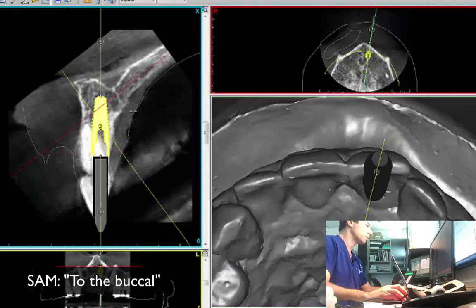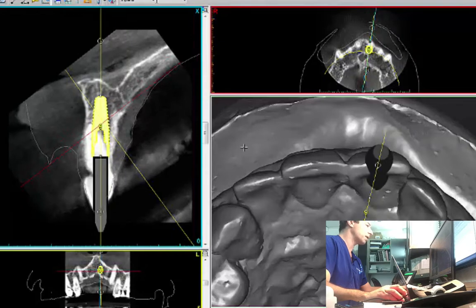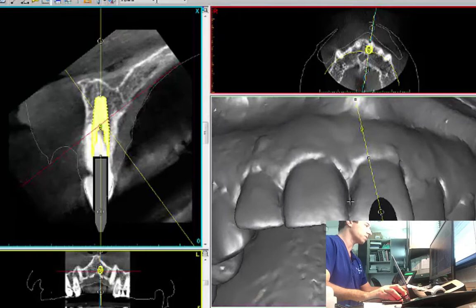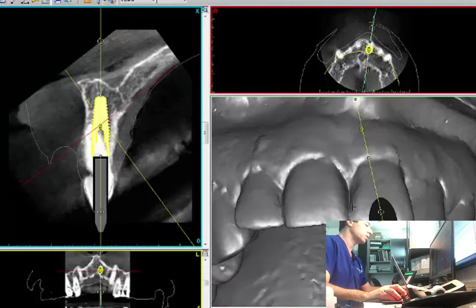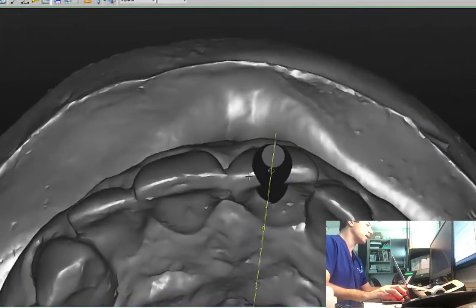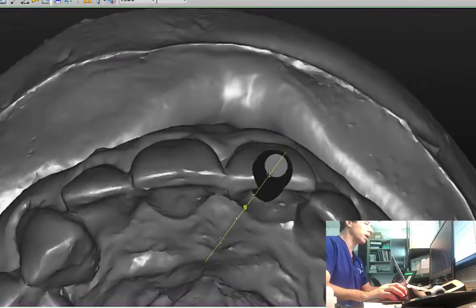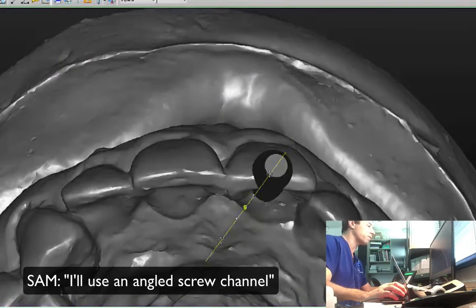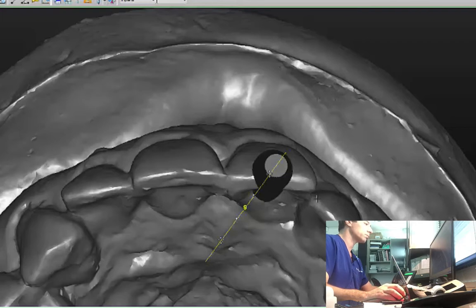To which direction? Buccal. Really? Yeah. So now you have the implant coming through the buccal surface. You mean as far as the screw? Well, you'll see that the trajectory of the implant is going beyond the incisal edge position. That's fine. What implant are you putting there? We're going to use a Nobel conical connection 4.3. I'll use an angled screw channel, 15 degree. I can get away with it.